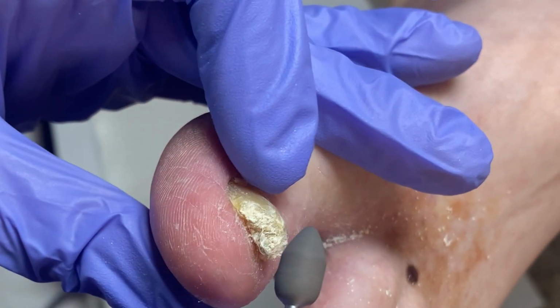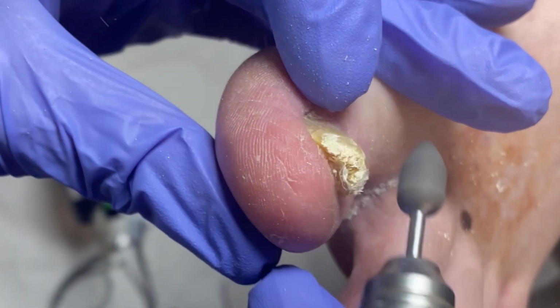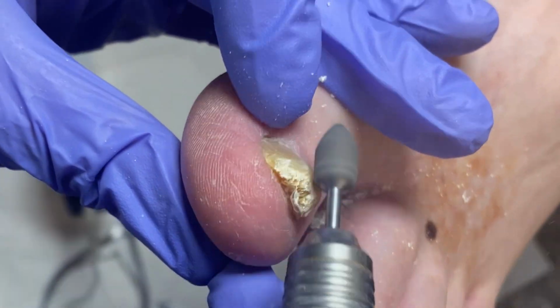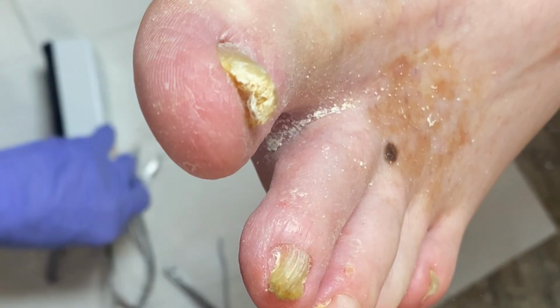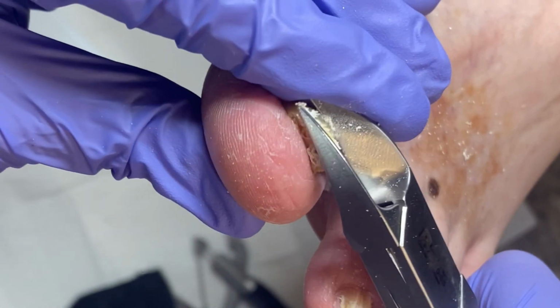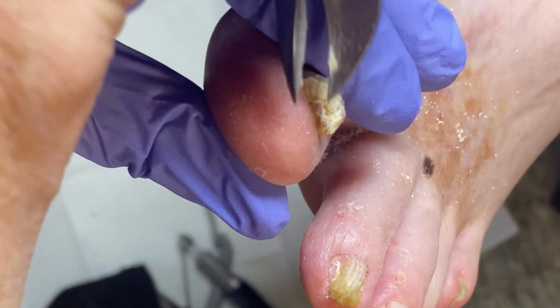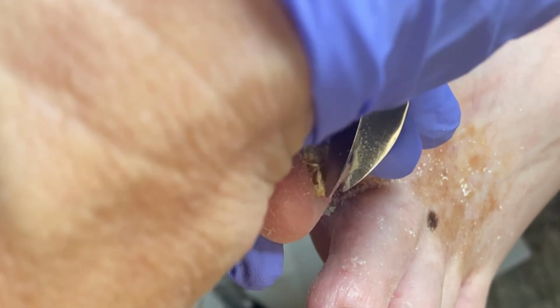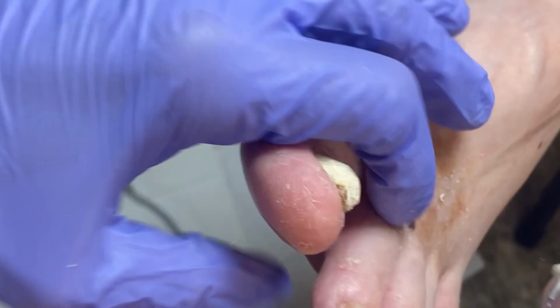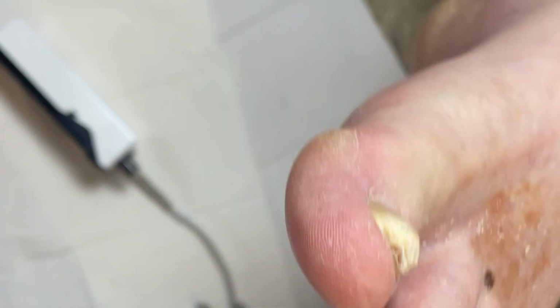Now, this is really hard to sand yourself. So it's probably easier for someone to do it for you. And it'll feel so much better getting all that thickness off of there. It puts a lot of pressure on the nail bed. And then you could sand a little bit more there too.